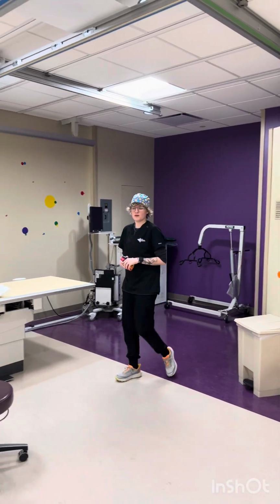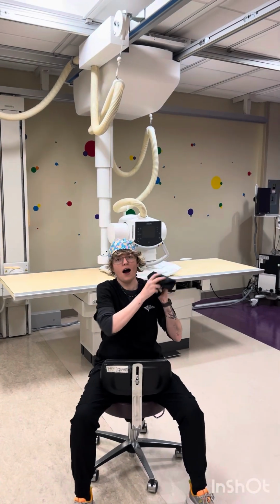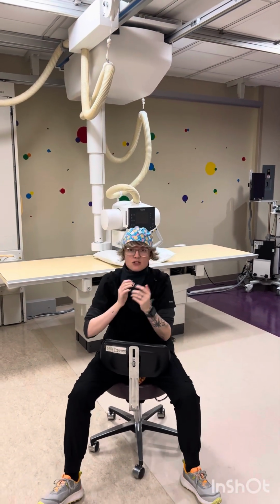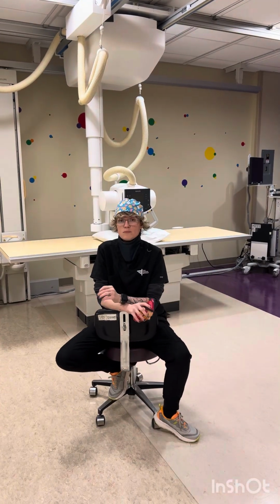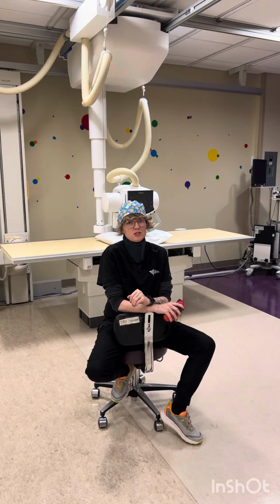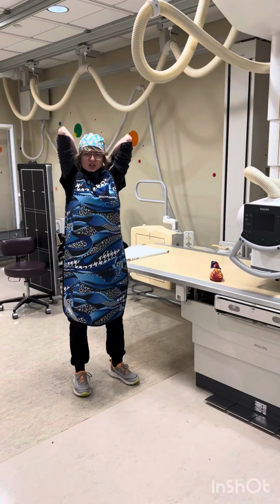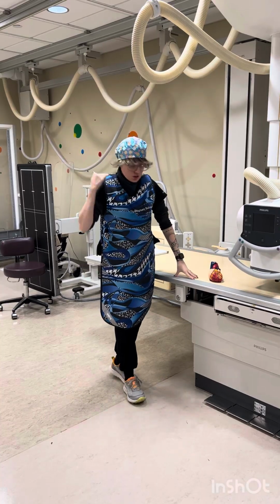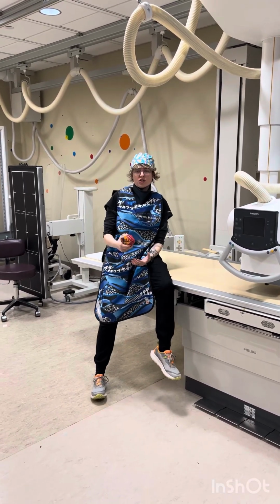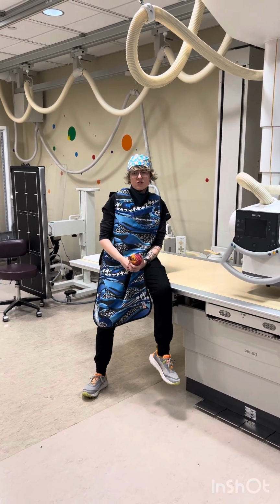Now that we're at the hospital, let's talk contrast. Iodine contrast agents are typically preferred due to their high atomic numbers, making them more effective at absorbing X-rays, which in turn produce clear, higher quality images of the heart and vessels. So, why use contrast? Contrast helps the cardiologist to better visualize coronary arteries, heart chambers, and other crucially important structures during a procedure.